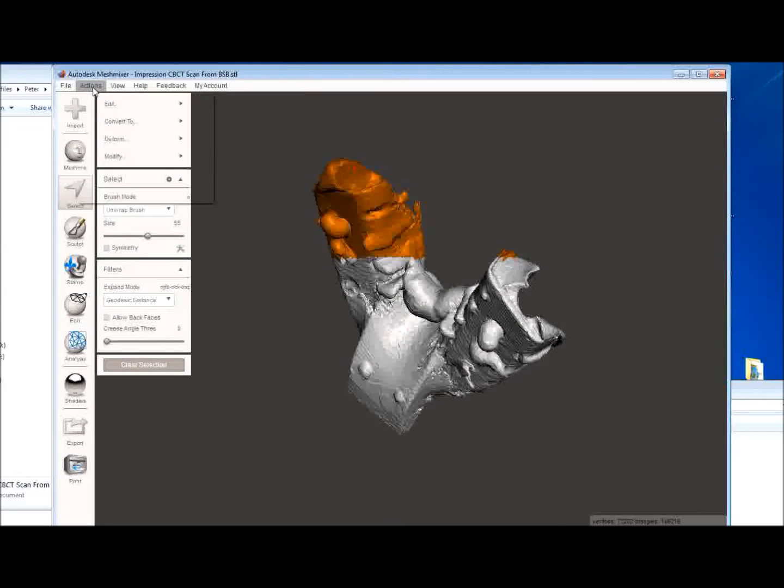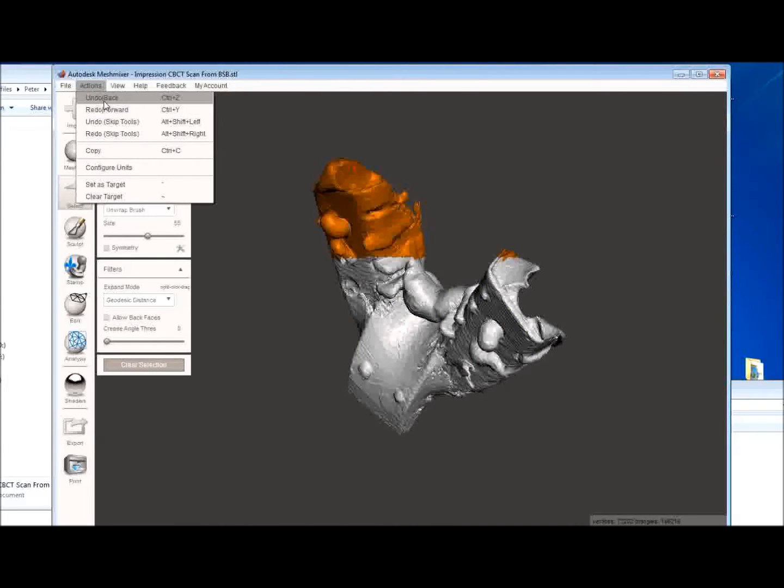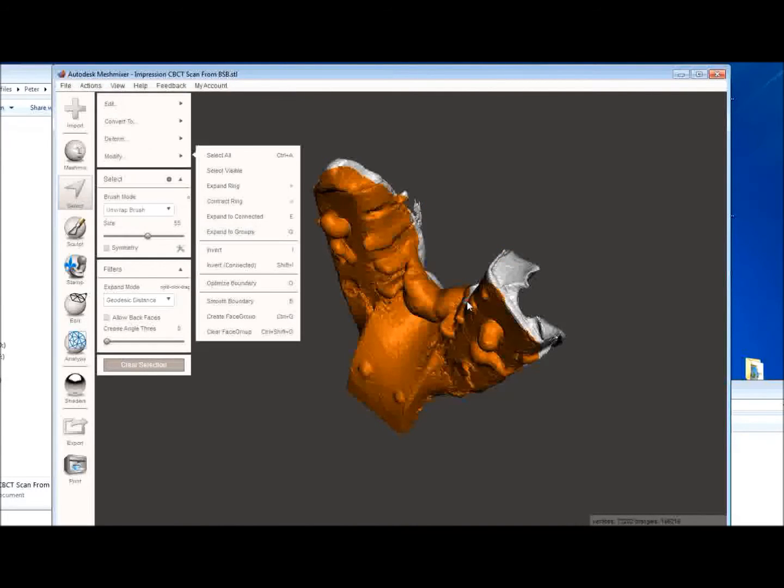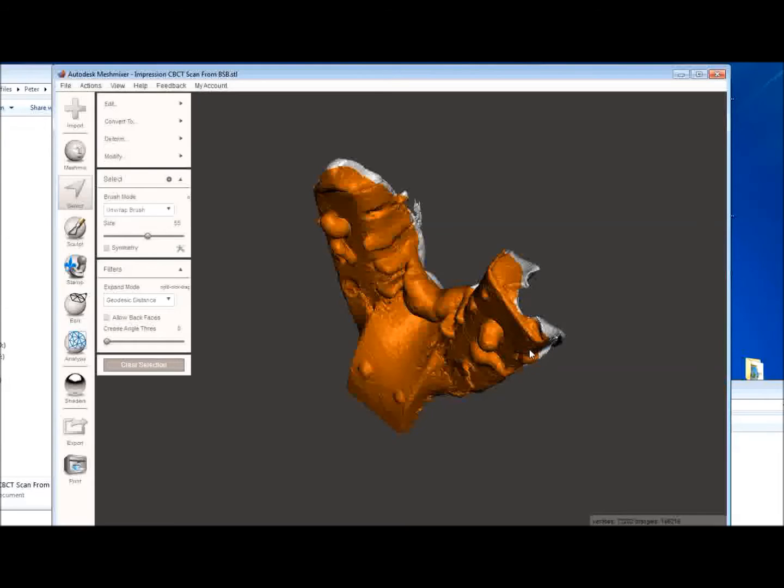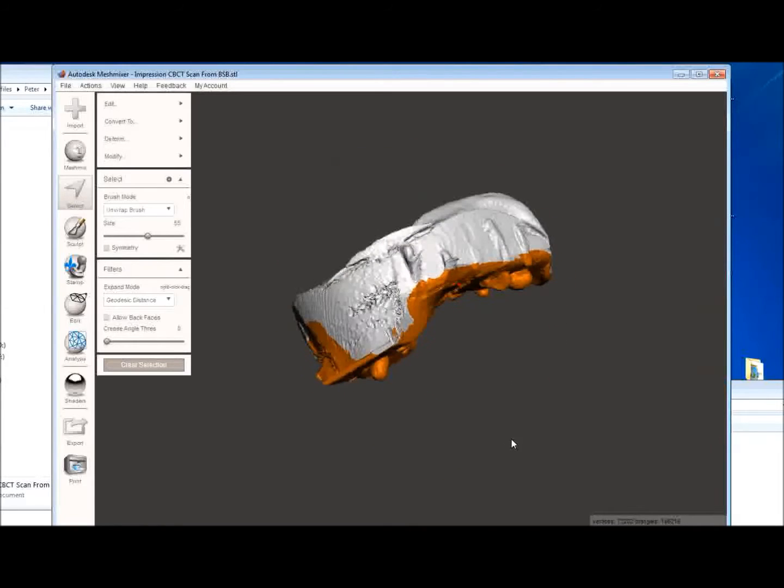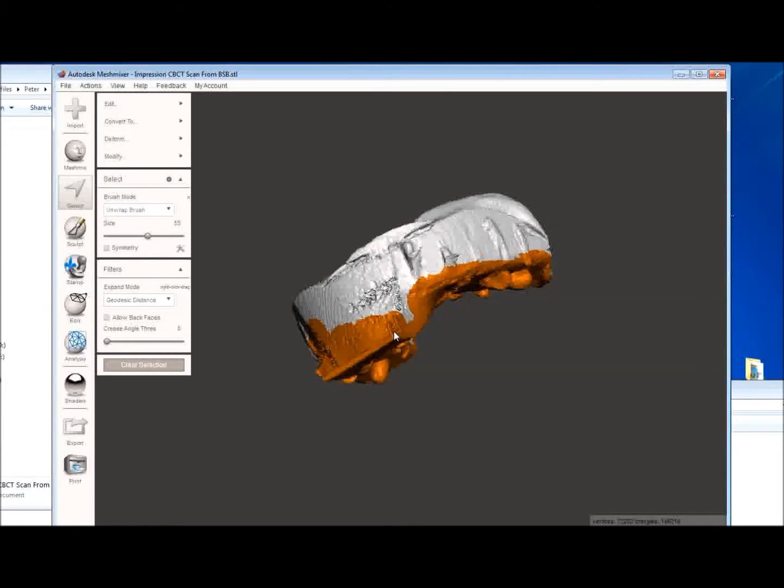Oops, I made an error. So we can go to actions, undo back, and keep painting away here. This shouldn't take very long at all. That's looking pretty good.